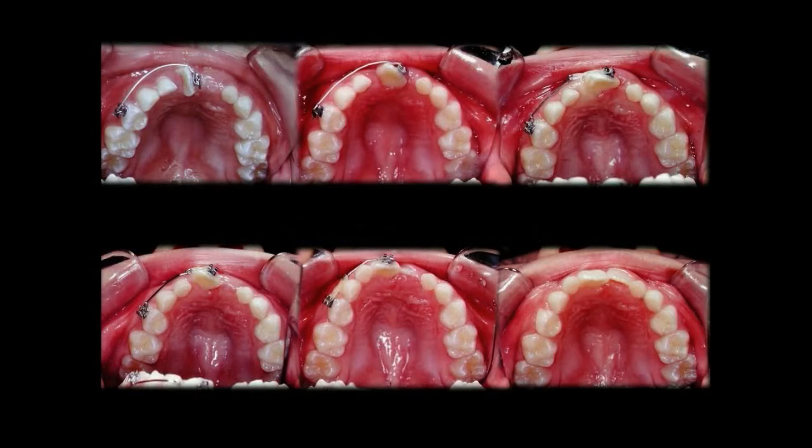Lastly, a primary tooth is also used as an absolute anchorage. More than 90-degree rotation of the central was produced pitted against a primary tooth. Only 2 brackets and a small piece of cantilever TMA wire was used.